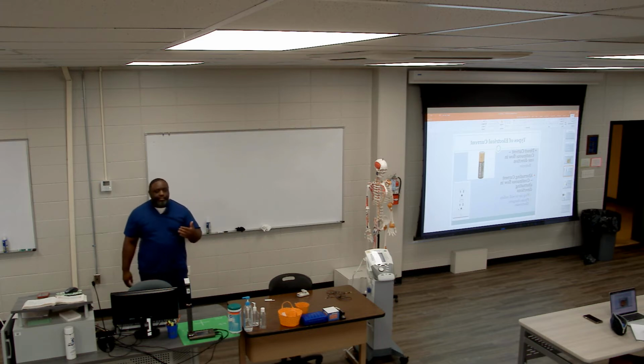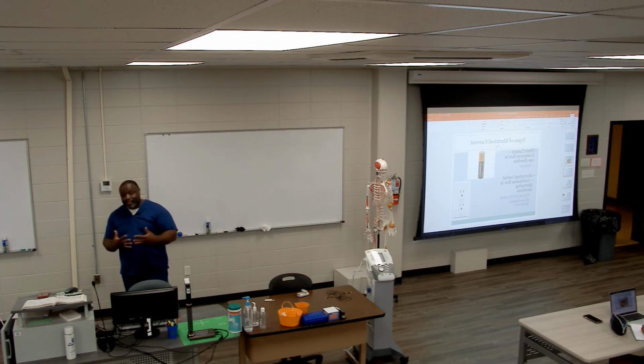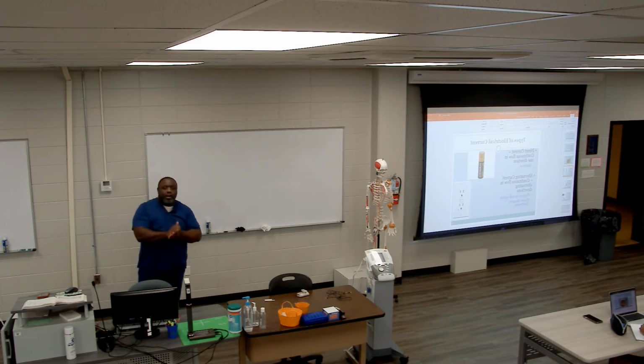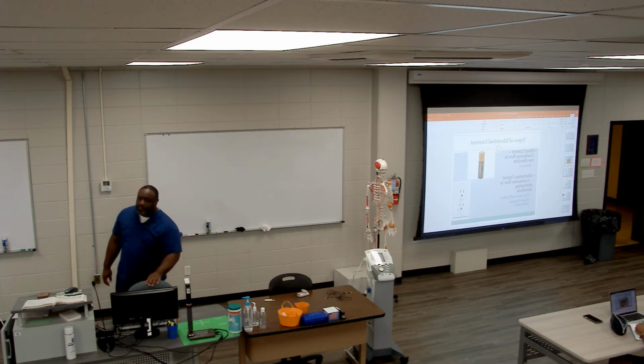It supplies current to a device as long as it is connected. If it disconnects from its source, then it would no longer provide power.